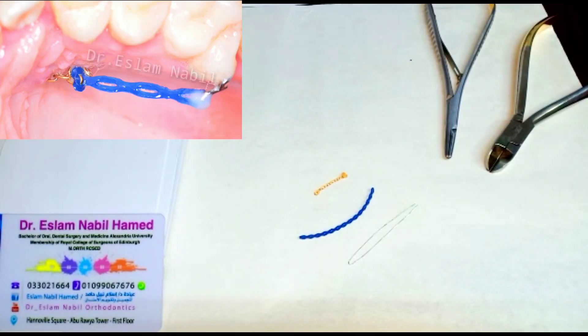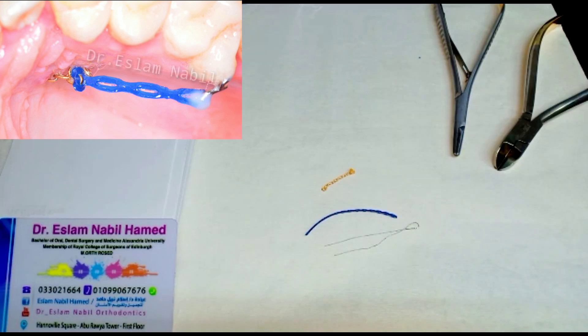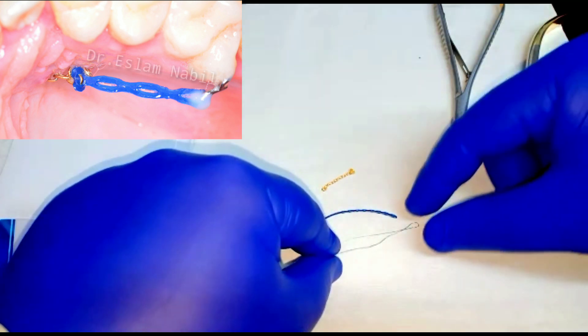Hello everyone, this is Dr. Islam Nabeel. I hope all of you are safe and healthy. Today I will share with you an orthodontic trick regarding how to tie the gold chain, the ligature wire, and the power chain together when doing the traction of an impacted canine. Let's do it — we will start with the ligature wire and the power chain.